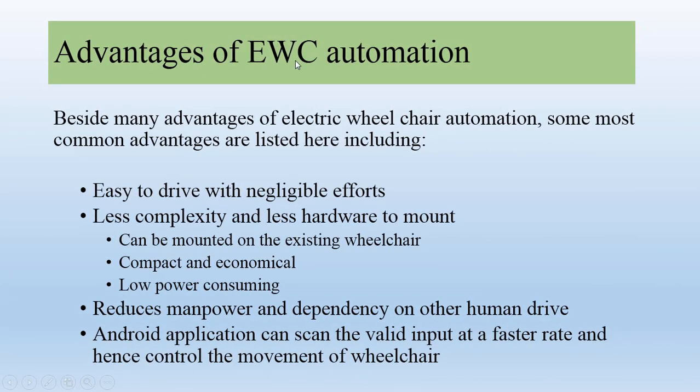Advantages of electric wheelchair automation. Beside many advantages, some of the most common advantages are listed over here. For example, automation of electric wheelchair will enable us to drive easily with negligible efforts, with less complexity and less hardware to mount on the wheelchair.